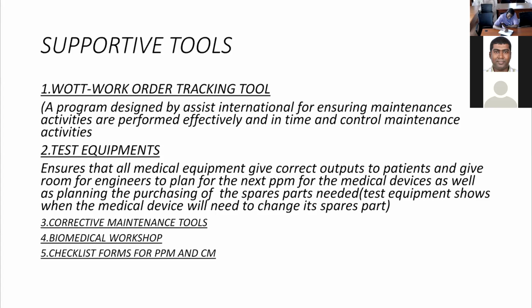This was designed by Assist International for ensuring maintenance activities are performed effectively and in time, and as well to control maintenance activities. It is a special program. It's very nice, it's very good, and it has largely contributed to having a high number of working medical equipment.